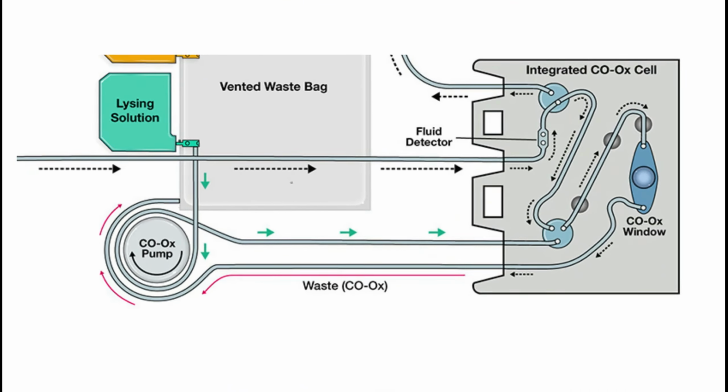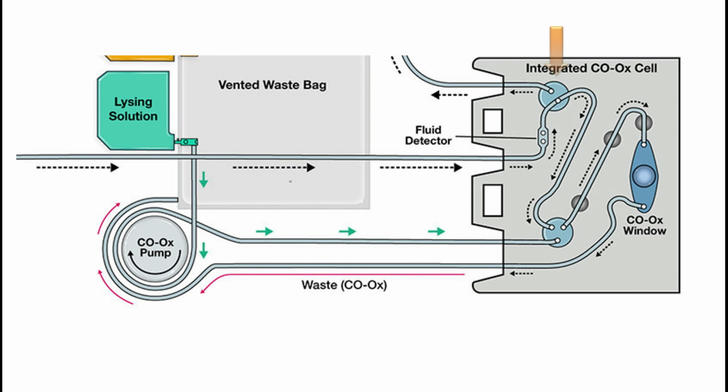It's worth noting that the blood sample is actually split here for whole blood to be diverted to the blood gas and electrolyte component and blood that undergoes lysing for co-oximetry. The lysing solution is on the top left. And if you ever wonder why the rinse cycle seems so long, look at all the work that the machine has to do.